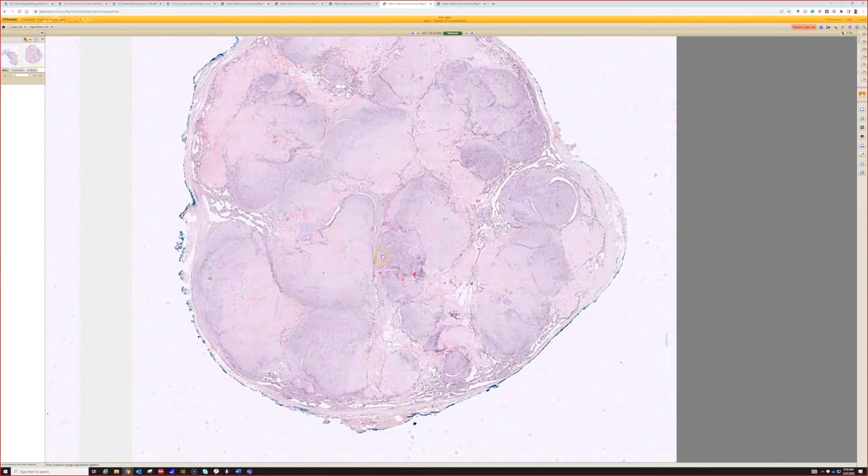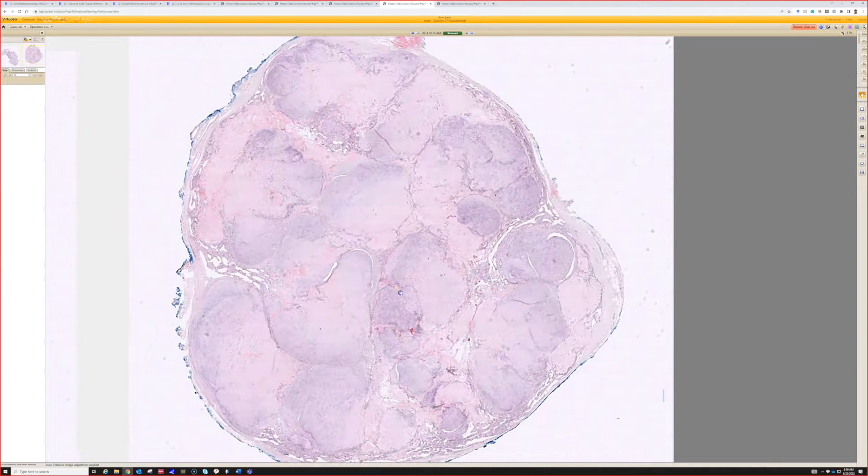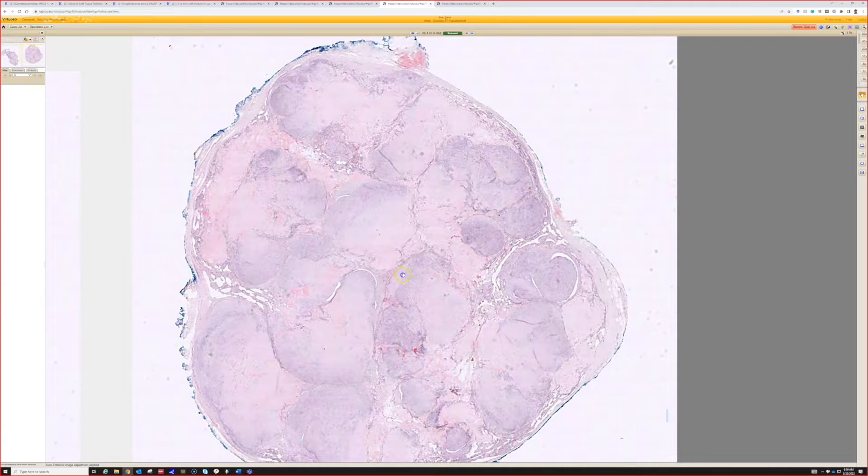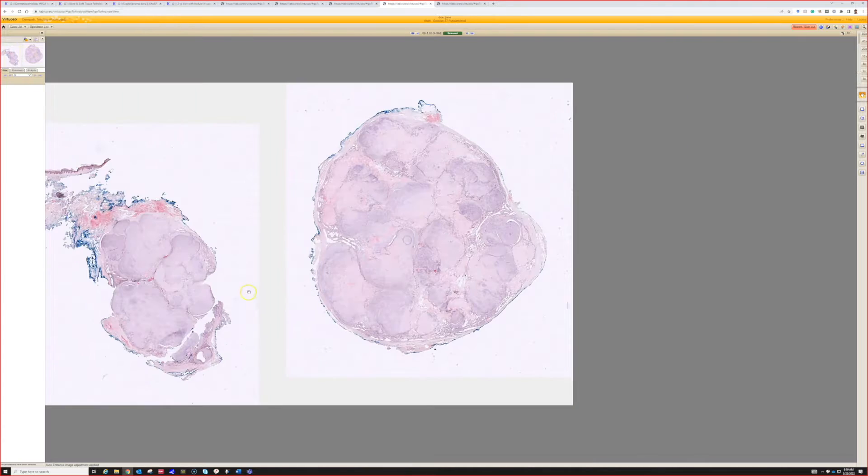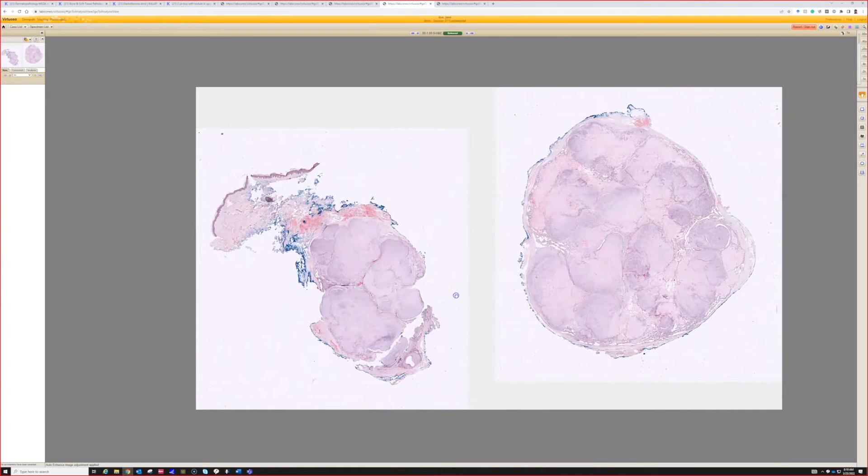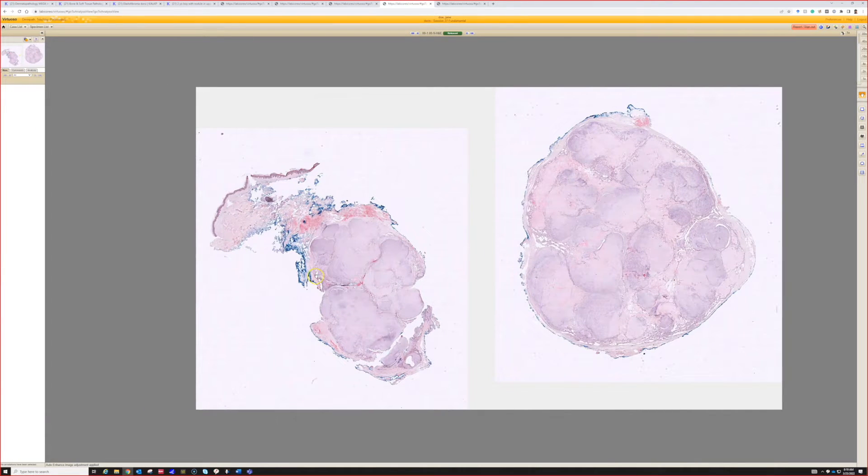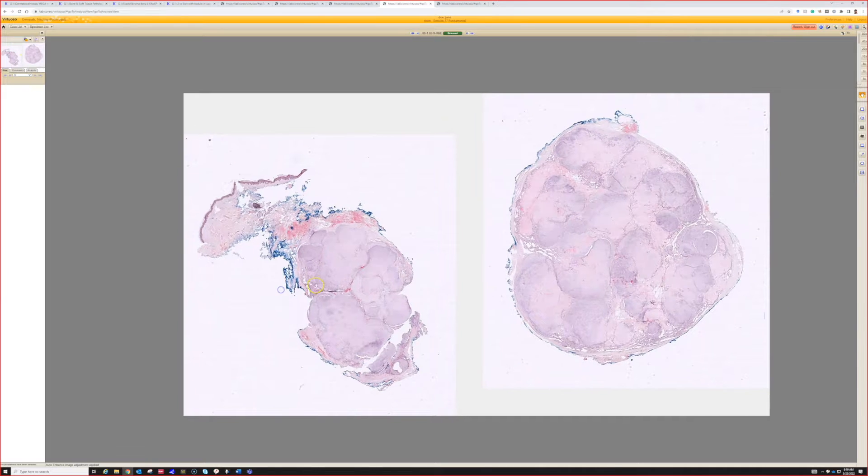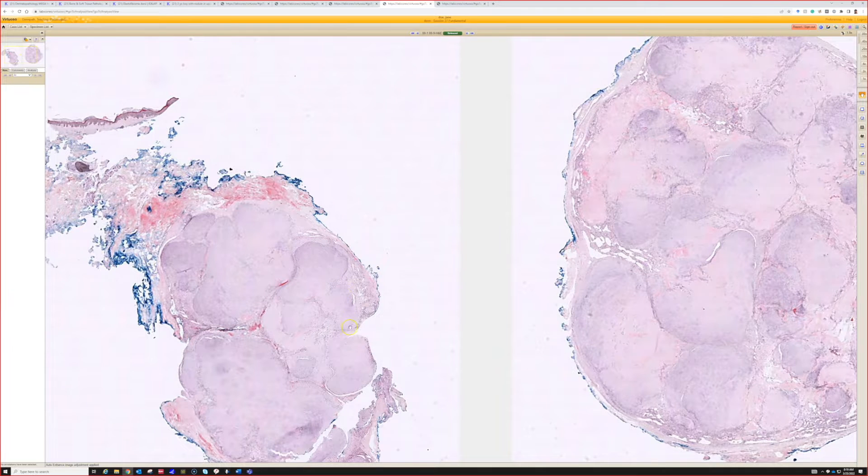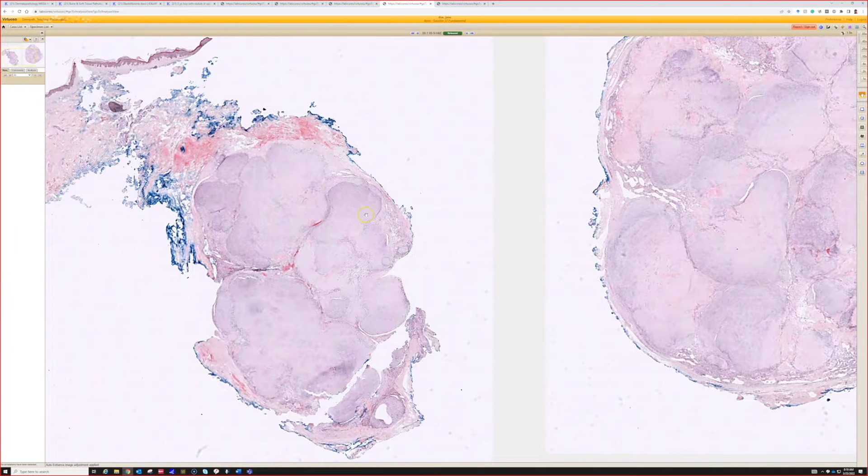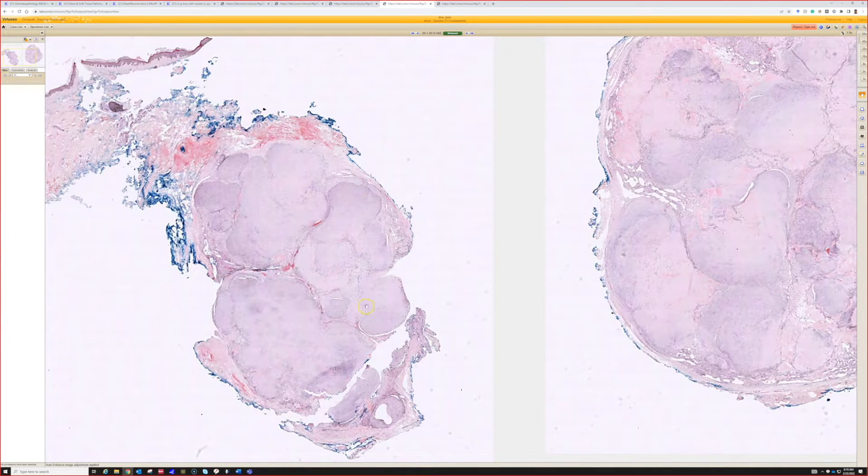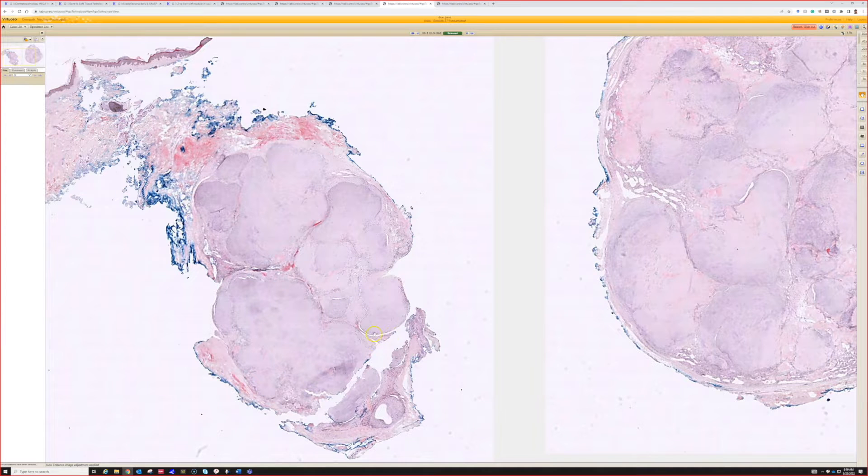We're looking at a pretty well circumscribed large specimen, and I've been calling this cotton candy colored - pink, purplish, with a little bit of blue, almost lavender too.